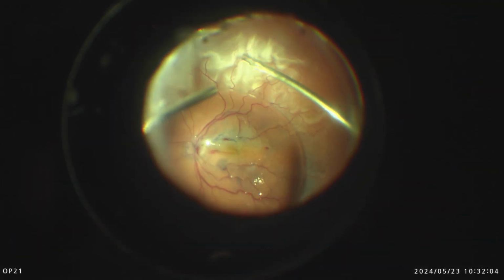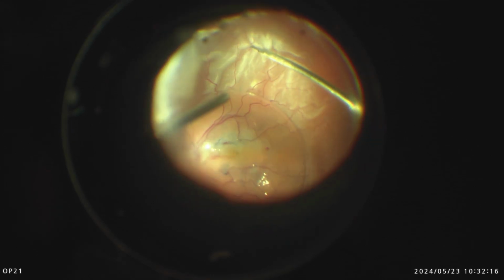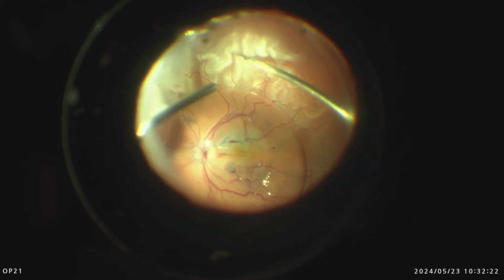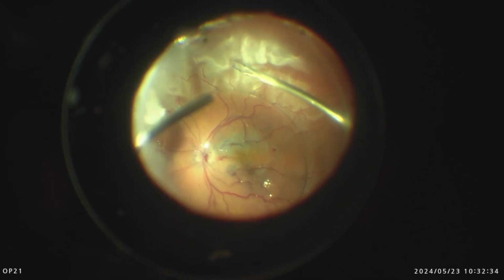Also, I've already inspected the periphery. You see those folds caused by that subretinal PVR ring, so there's nothing to peel there as well. So I decided to do a 360 retinectomy as anteriorly as I could and remove the remnants of that subretinal PVR, which I couldn't remove earlier.